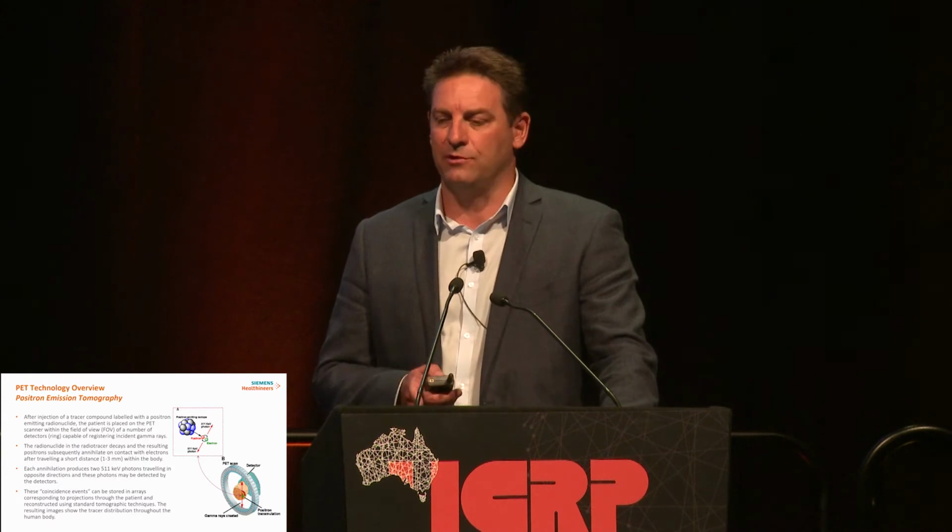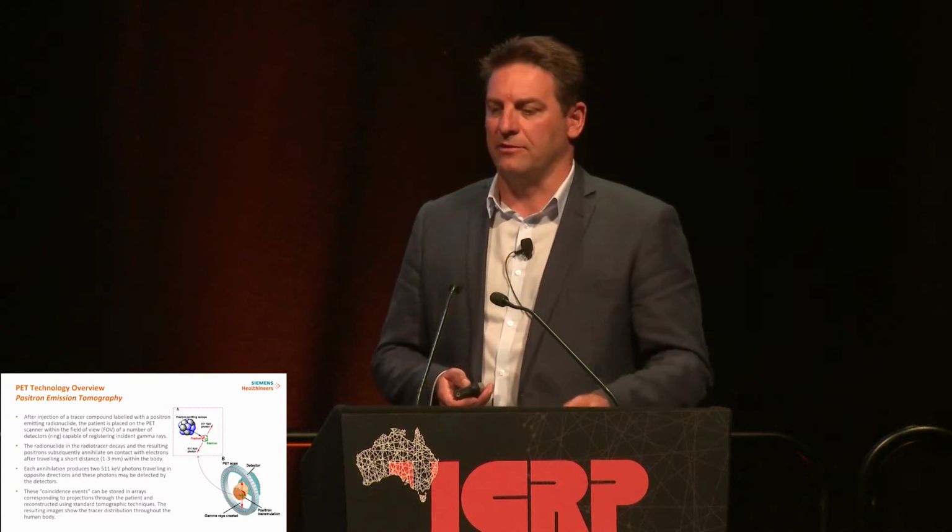That patient is then put onto a bed into a detector ring within the field of view, and we're able to capture those incident photons. Through the decay, as the positrons are released, they annihilate with an electron, and two 511 keV photons are given off at 180 degrees to each other. And from that, we're able to build up an image. So areas of increased activity are essentially able to be demonstrated on the scans.